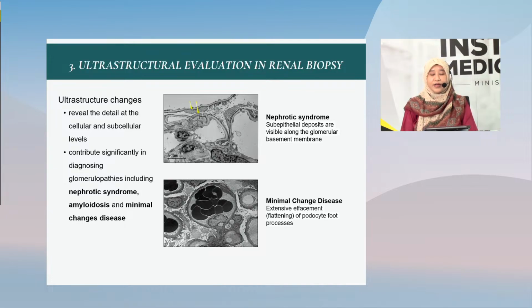Imaging of renal biopsy tissue by EM allows the assessment of ultrastructural changes in the sample, where this imaging can reveal detail at the cellular and subcellular level and contribute significantly to the diagnosis of renal disease.